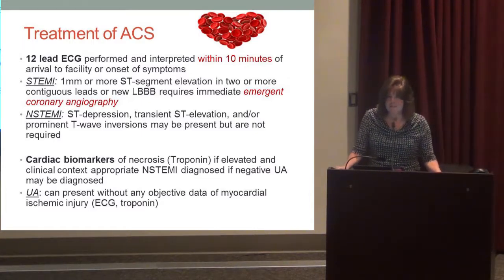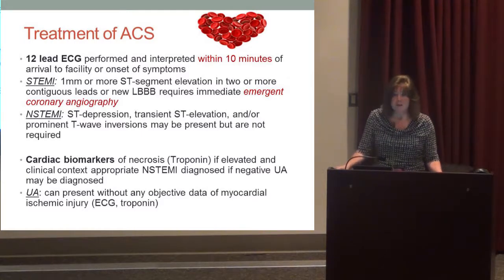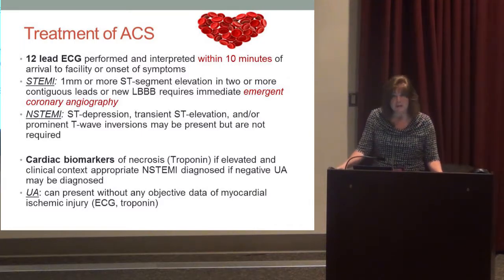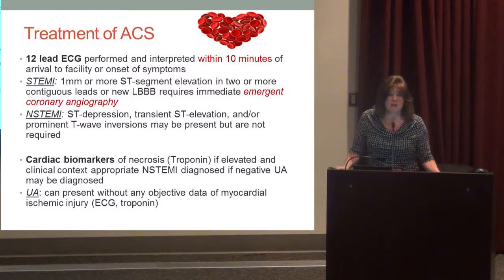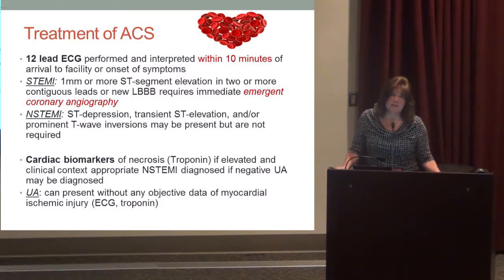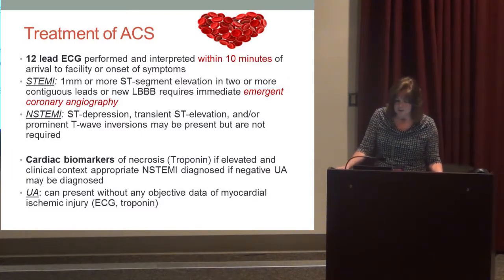We've got to wait for those lab values to come back, because they're not going to have that obvious ST elevation on the EKG. So you do your labs, and if they have positive cardiac markers, that's when they say that they are non-STEMI. Okay? But they might show some ischemic-looking EKGs, which we know is T-wave inversions or some T-wave or ST depression. Those little subtle signs on the EKG while we wait for enzymes, and those are our non-STEMI patients.